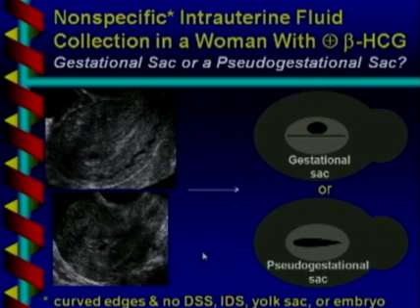So let's take a look at these potential pitfalls. Here are two patients, two rule-out ectopic patients. They have a positive pregnancy test, pain, and bleeding. They come for an ultrasound, two different patients, but with similar findings.